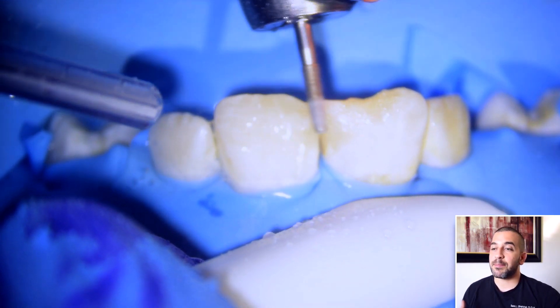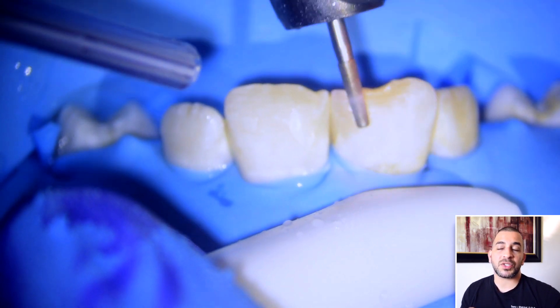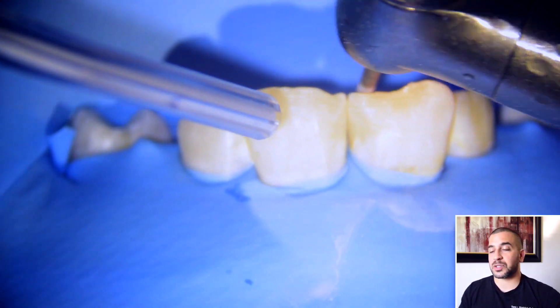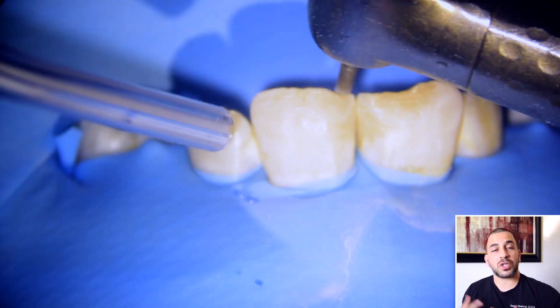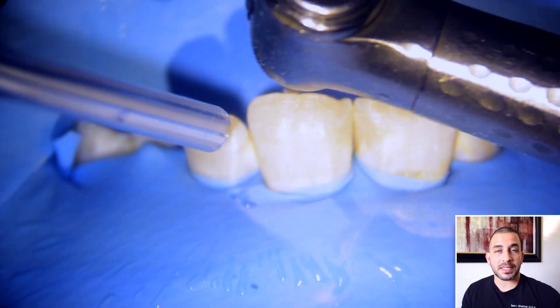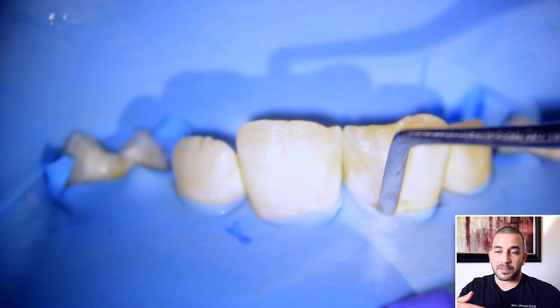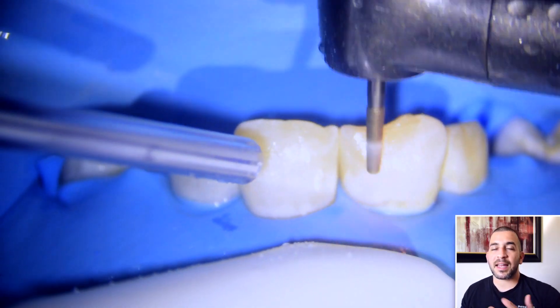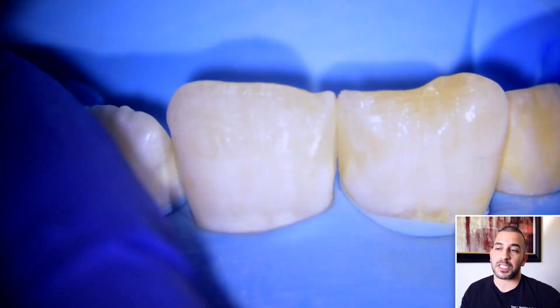Here you're going to see me bevel the tooth. I'm not trying to be aggressive in my bevel but I do want to extend it two to three millimeters past the fracture of the tooth, and I just roughen up the surface of the tooth so that we have more surface area to allow the bonding to be very strong. At the very end I create these vertical strokes — a star-shaped pattern to my bevel — and that allows the composite resin to blend in a little bit more naturally towards the end of the procedure.